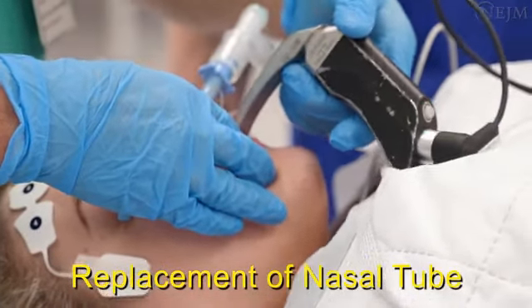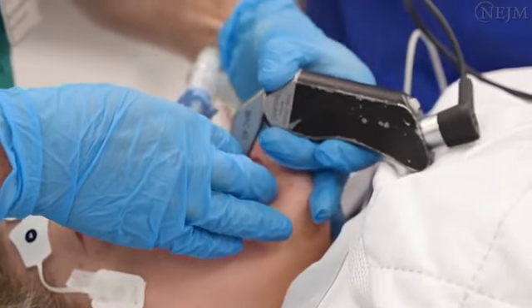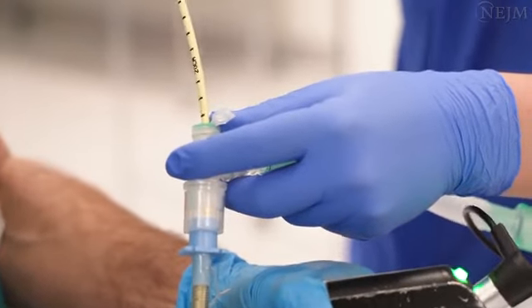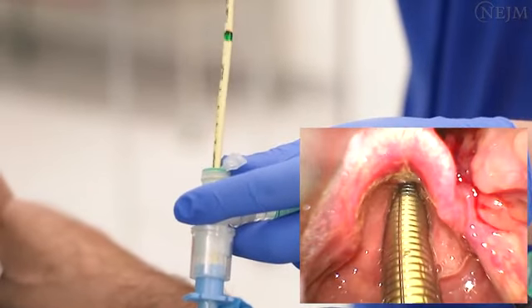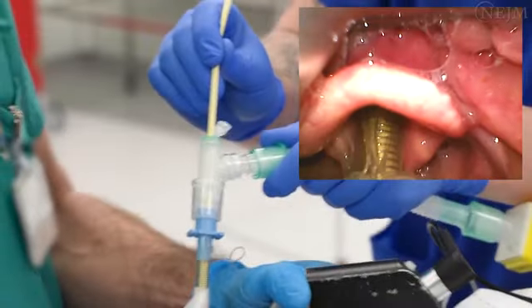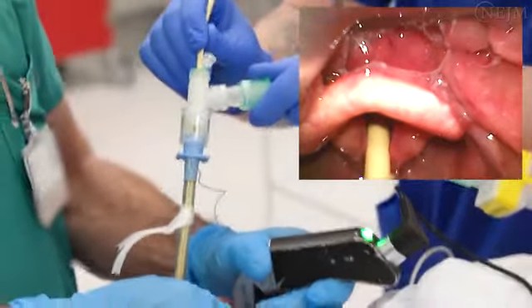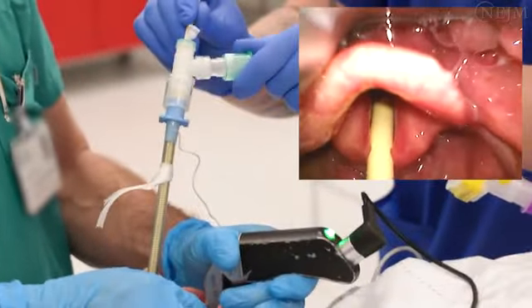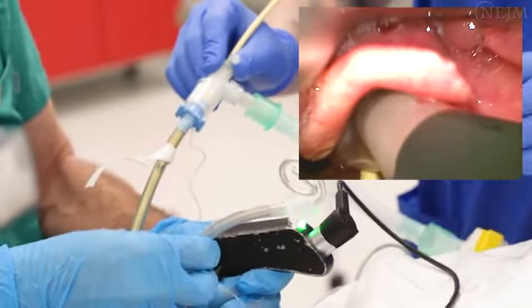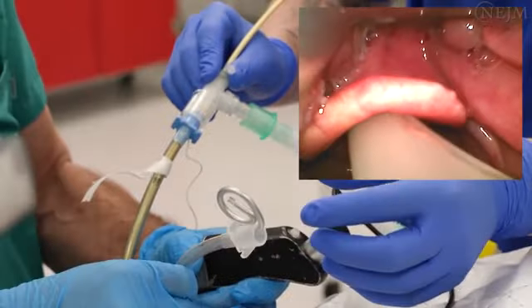To replace a nasal tube with an oral tube, begin by inserting the video laryngoscope. If you can visualize the glottis, advance the lubricated airway exchange catheter through the previously attached adapter until the catheter reaches the determined mark. Under direct visualization, withdraw the nasal tube to the level of the hypopharynx. Advance the new oral tube with the attached stylet alongside the airway exchange catheter until the cuff cannot be seen.